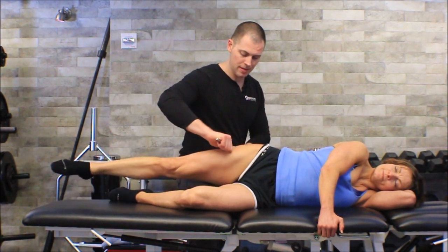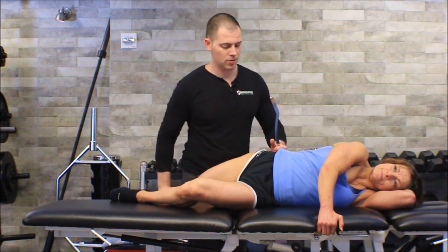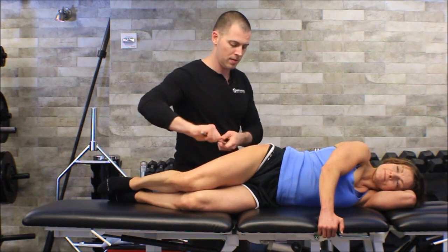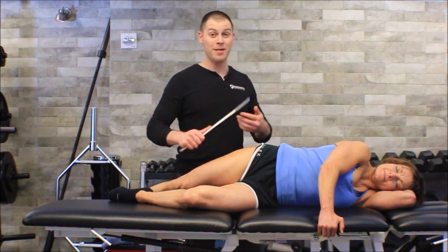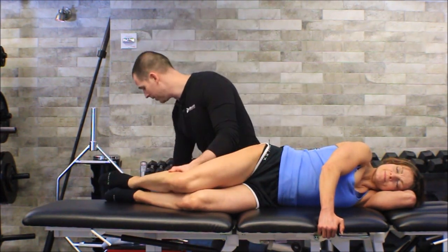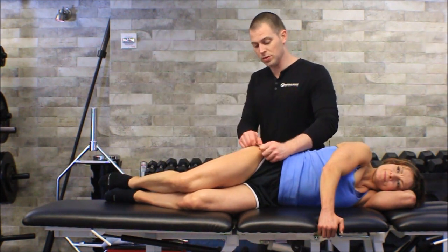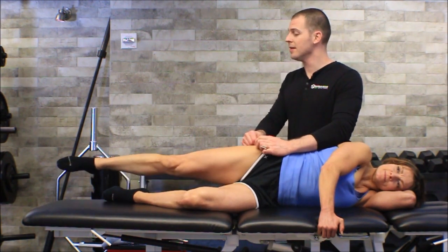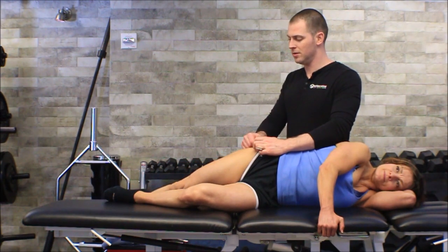Let's get up here — go ahead and extend and fall off. Try not to rotate your hips this time; let's keep your hips forward. For the TFL, gluteus minimus, the area above the greater trochanter, you could absolutely use a smaller tool, maybe the shark tool, and stand this way. So go ahead and extend farther back and then let your foot fall off.